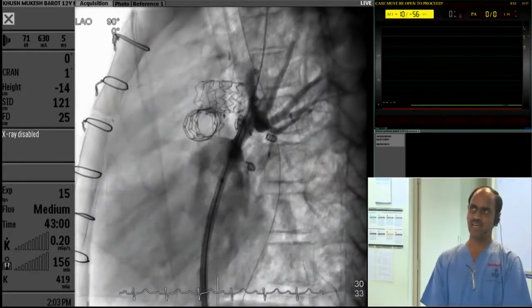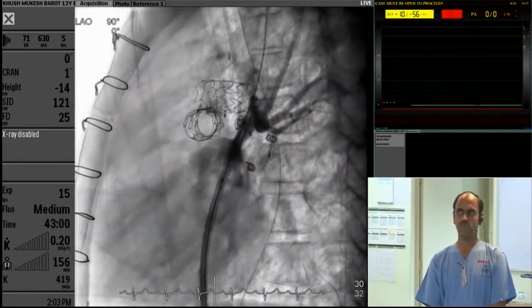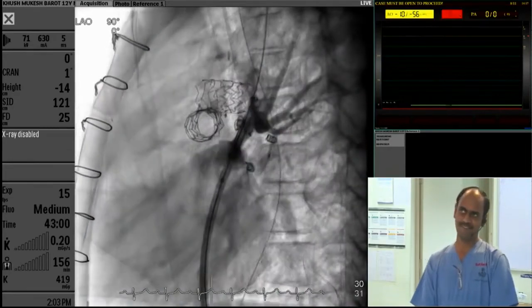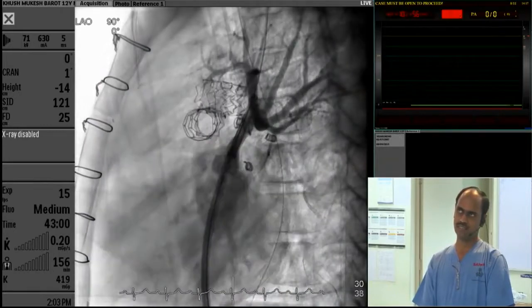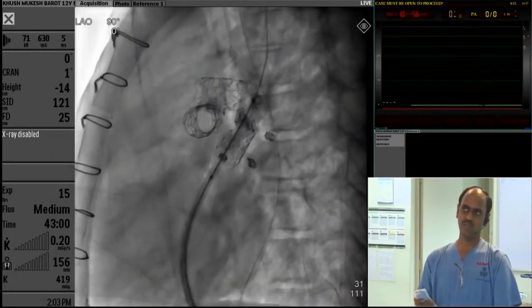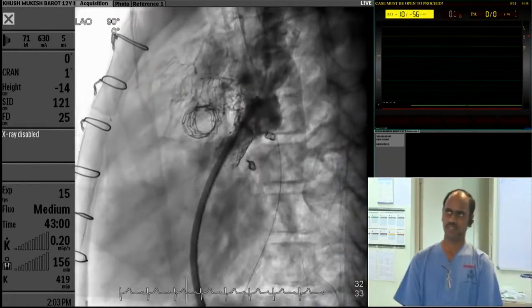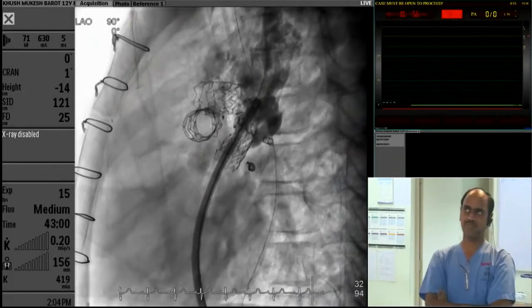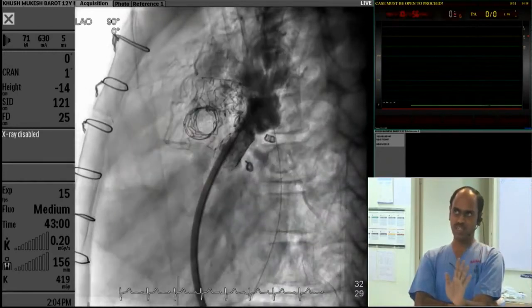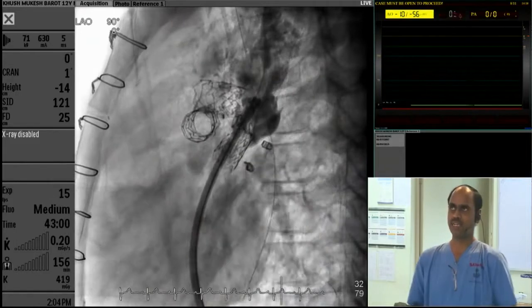This is the stent. Can you see the narrowing and the stent in correct position? I am deploying the stent. After injection, there is no flow. The azygous is still filling. What shall I do? Hemodynamics are stable. The air in the ascending aorta has disappeared. The patient looks stable. It looks like some kind of dissection into the SVC.